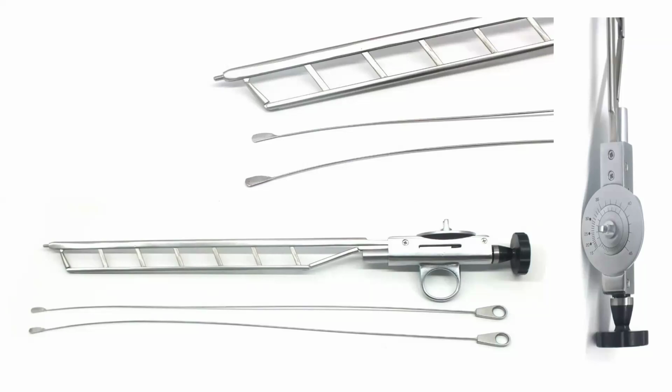So you will put it up to what? Only anterior urethra or up to bulbous urethra? Distal to membranous urethra. Yeah. So you are going to cut mainly the penile urethra, correct? Fine. Yes, sir.